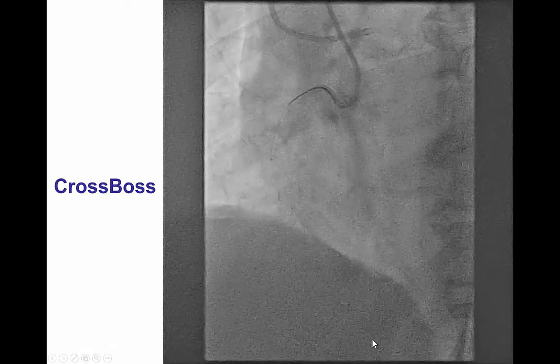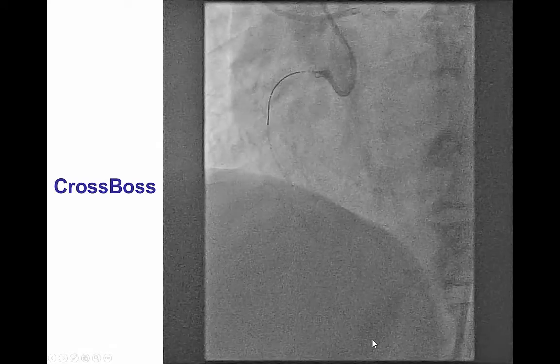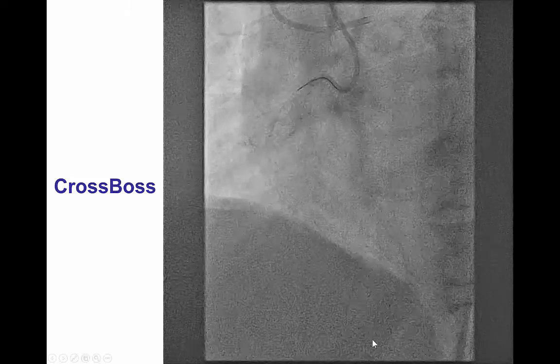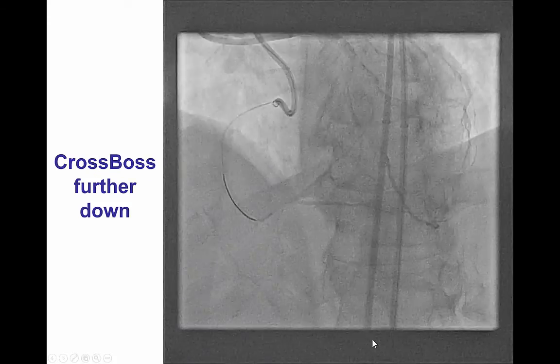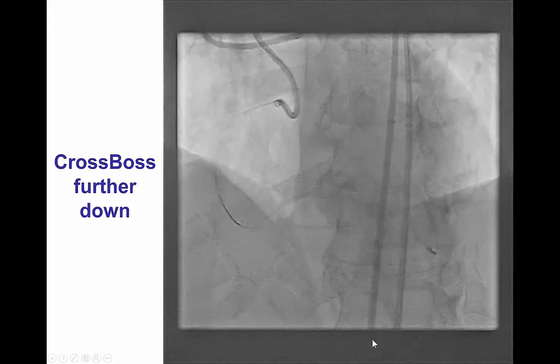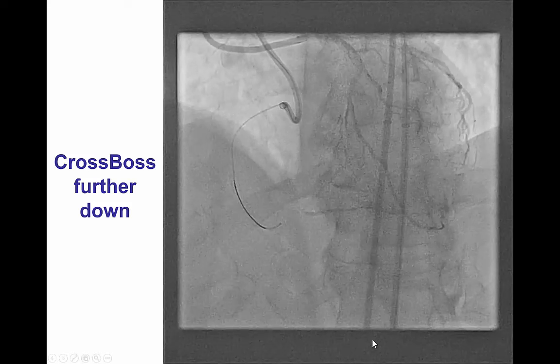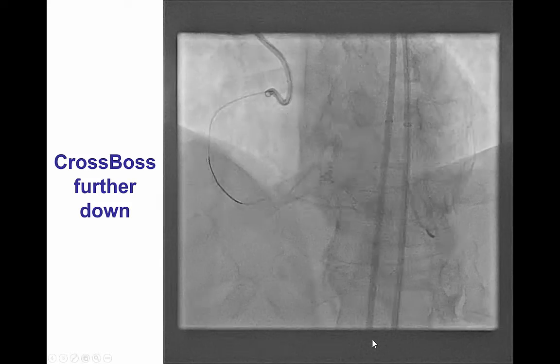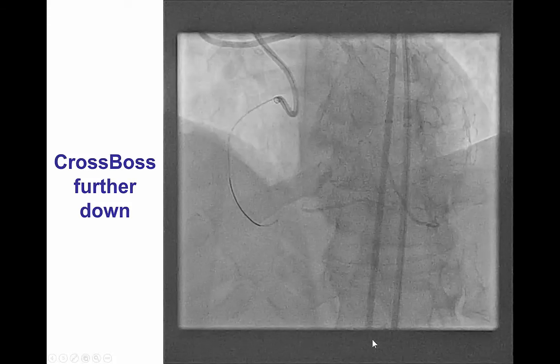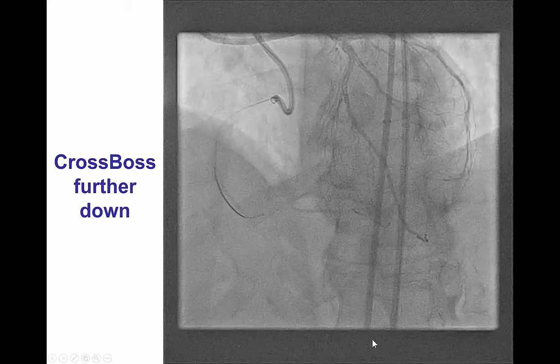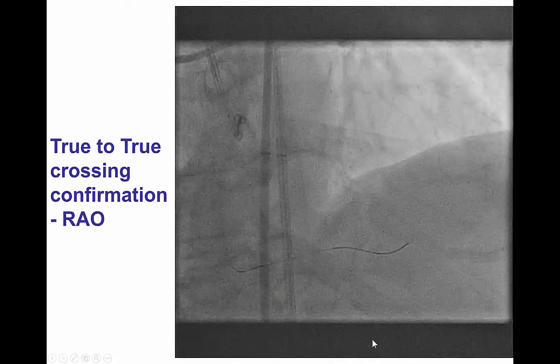This is the CrossBoss catheter that was advanced very easily through the in-stent occlusion and crossed all the way to the distal cap fairly quickly. This is an example of how the CrossBoss can be fairly advantageous for chronic total occlusion due to stent restenosis.